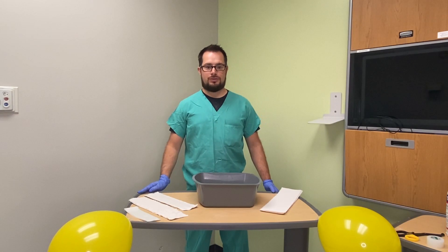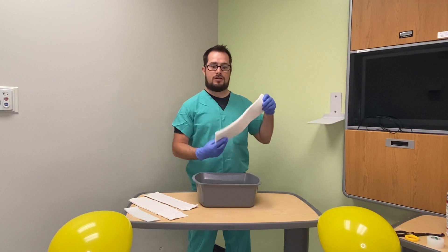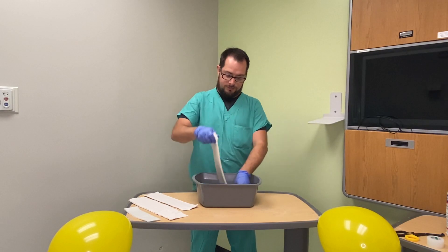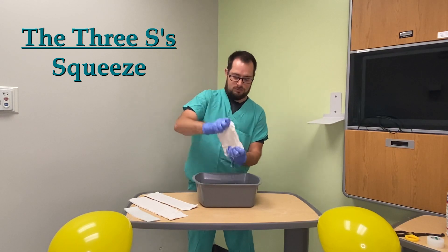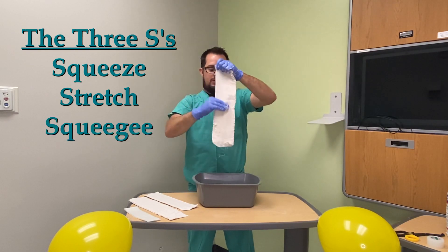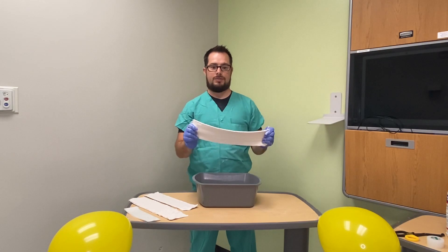Once you have decided on the splint you're going to do, you need to pick the correct style and size of plaster and properly fit it to the patient. Once you've done that, you are ready to dip your plaster. Hold the plaster by both ends and dip it into the water. Then I say do the three S's: squeeze the excess water out, stretch the plaster back out, and squeegee the excess water out. You want to make sure your plaster is nice and smooth, and now it is ready to be applied to the patient.